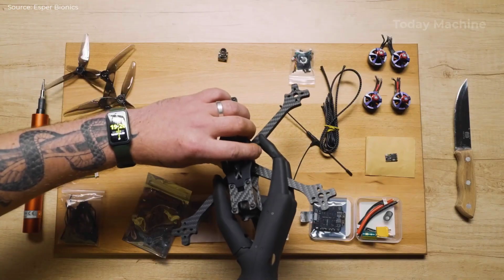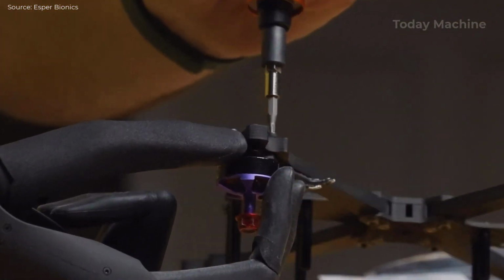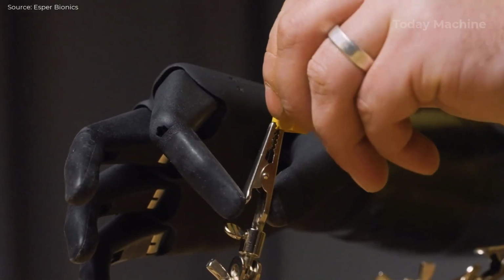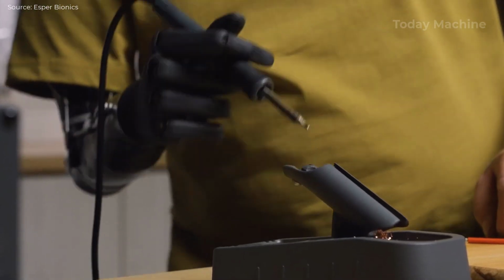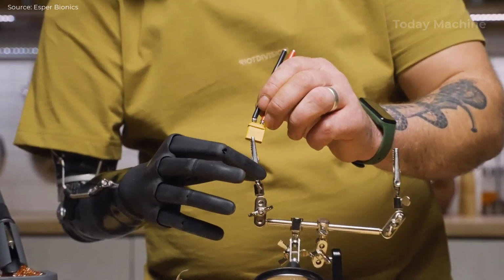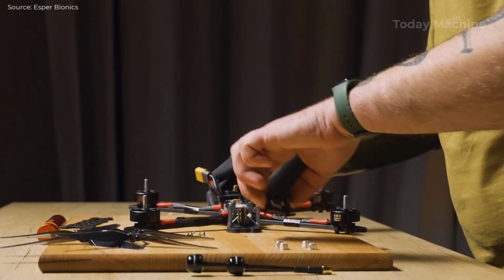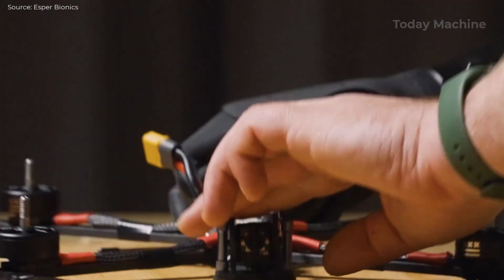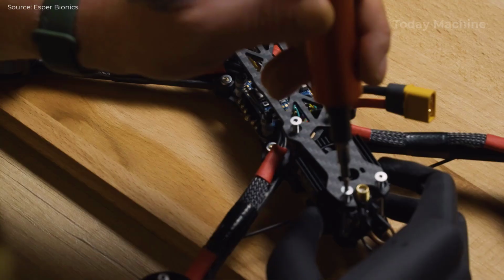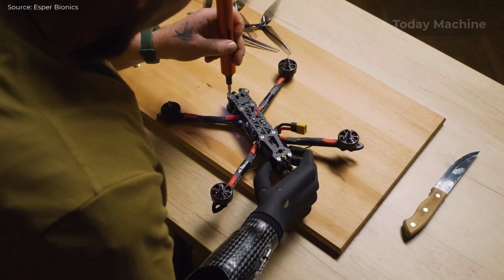Esper control. The Esper control is a non-invasive electromyography-based brain-computer interface that allows the user to control the hand through muscle signals. The system works by detecting muscle activation in the residual part of the limb. When a muscle is activated, a voltage drop occurs on the skin surface. The Esper control sensors detect this voltage drop and analyze the pattern to determine which muscle has been activated. This information is then used to control the movements of the Esper Hand, allowing the user to perform various tasks.